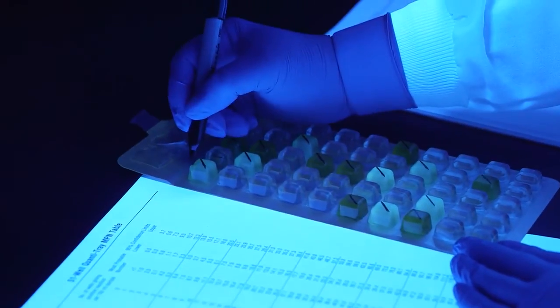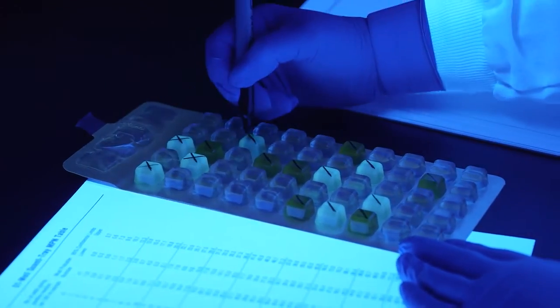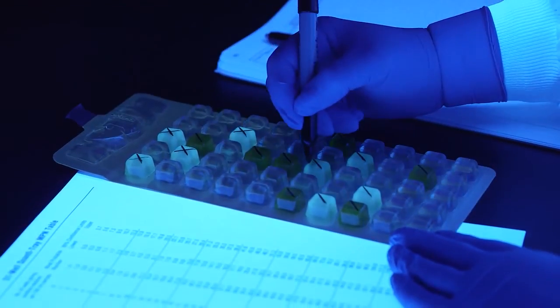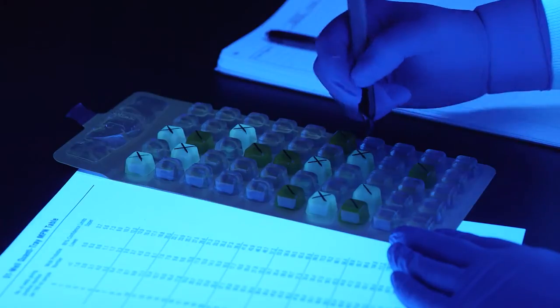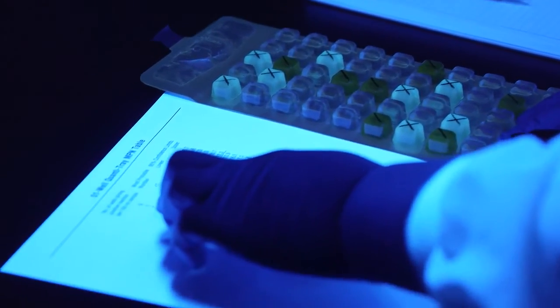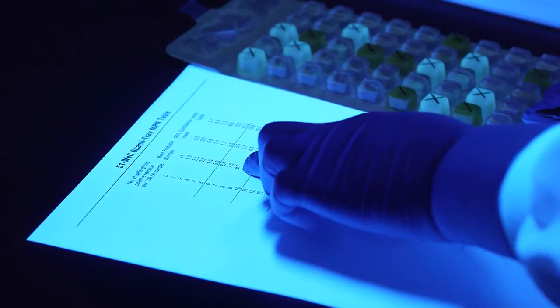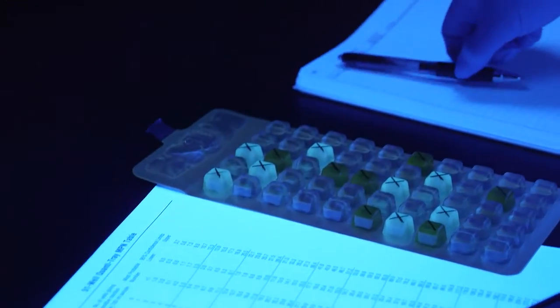To determine the number of E. coli, view the QuantaTray with a UV lamp in a dark environment, shining the light away from your eyes. Keep the light within 5 inches of the tray. Count the fluorescent wells that are equal to or greater than the comparator, and then refer to the MPN table. The most probable number of E. coli for this example is 8.7 per 100 ml.